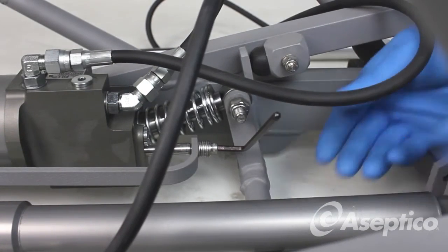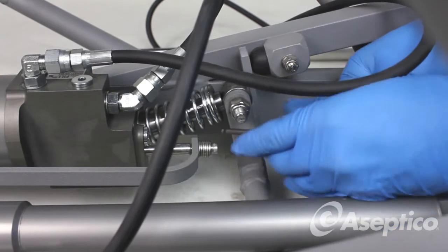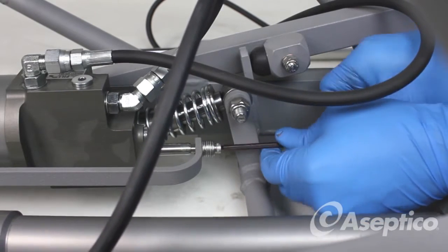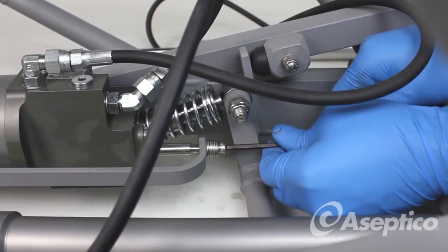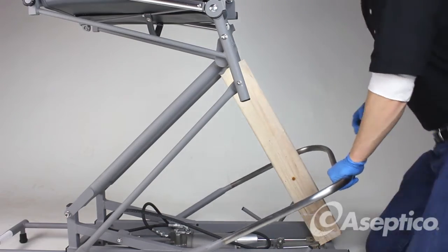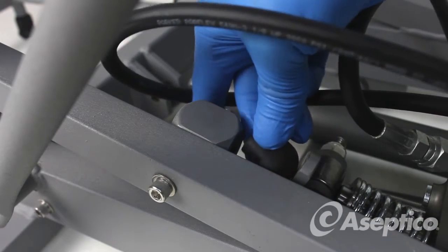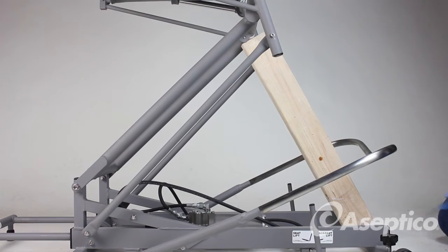To remove the linkage selector, use a 5/32-inch Allen wrench and remove the bolts. Note the number of washers in front and behind — configurations may be different and reassembly should be exactly the same as disassembly. Remove the rubber stopper, push down on the foot pedal, then twist and pull out. Use a rope or tie strap to tie down the foot pedal.